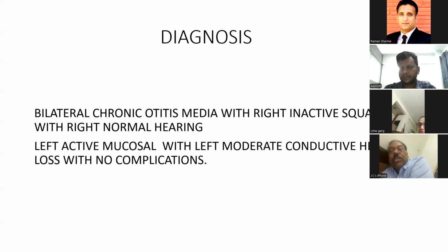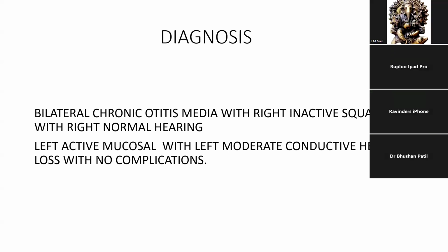Okay, sir. As such, in this single film that you have shown, it is not convincing about your diagnosis of the right side. Absolutely, sir. It is soft tissue. Madam Dr. Sukhdeep has already hinted that this seems to be a self-cleansing attic on the right side. Yes.